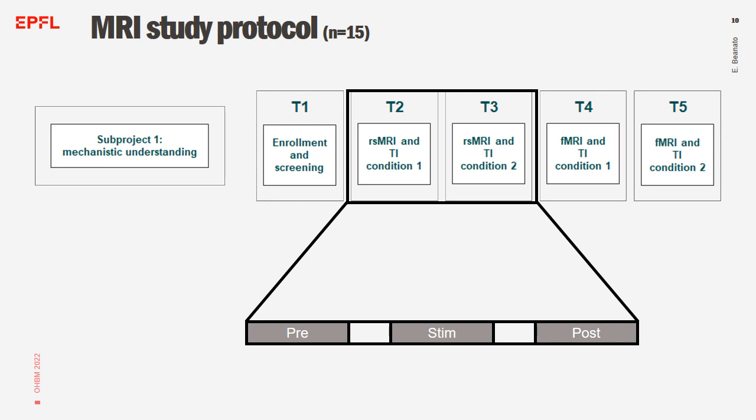Participants performed 3 scans at each visit of around 8 minutes before, during, and after stimulation, and either the active or the control protocol was used in a randomized order.